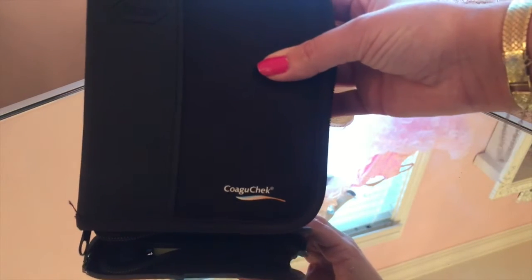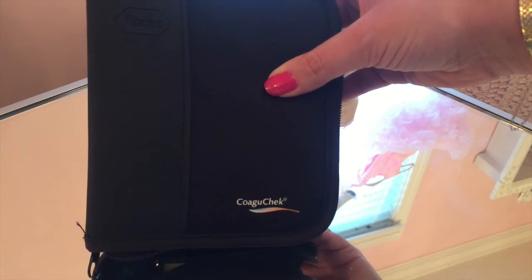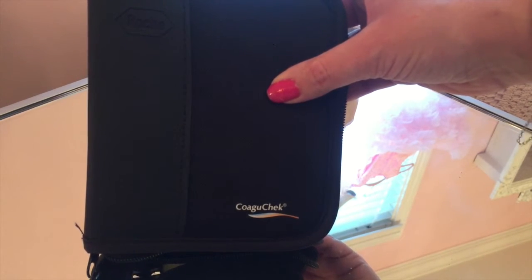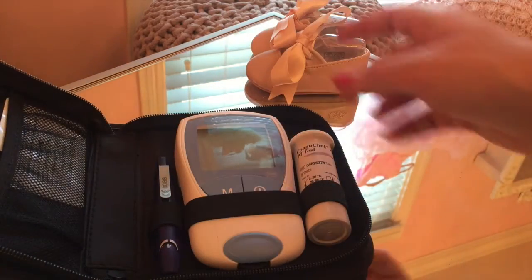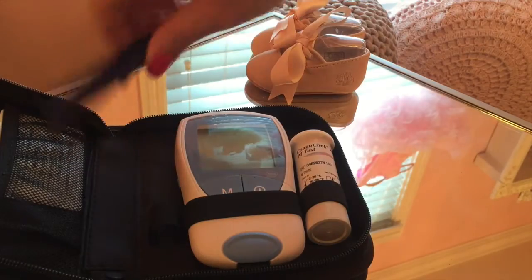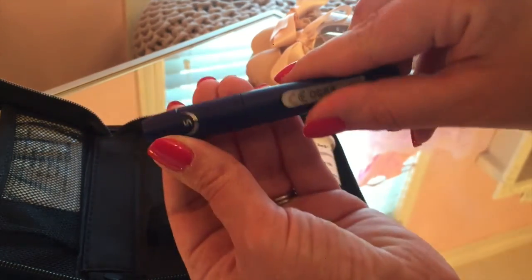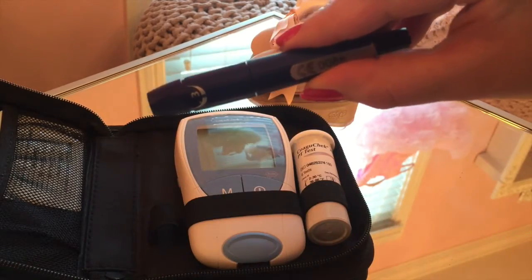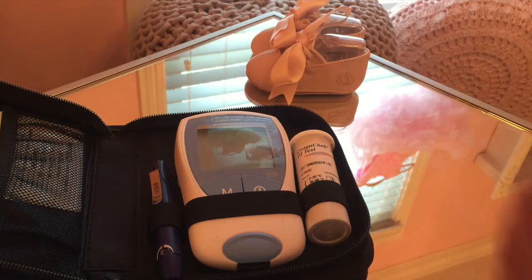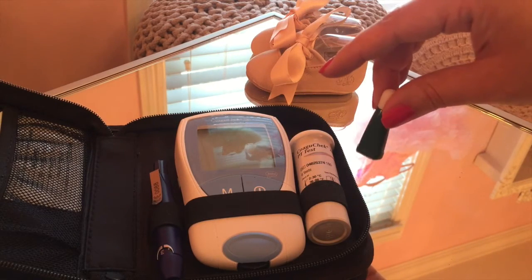If you're lucky enough to have a machine, they're not that difficult to use, but it does take a little bit of explanation. So I'm going to run through it real quick. I've got the CoagCheck and it's very nice. It comes with the machine and with the actual pricker that you can adjust the depth. I personally don't use that one because you have to fumble with the needles. I choose what I call the Christmas trees — the disposable prickers that come with it as well.